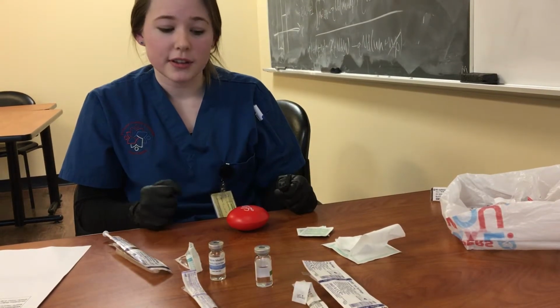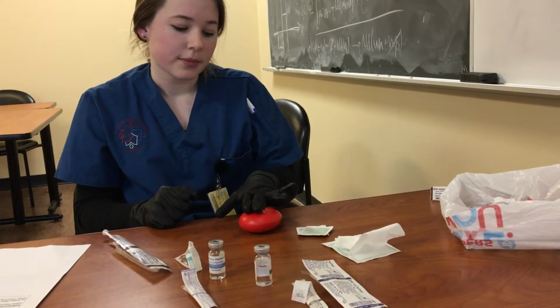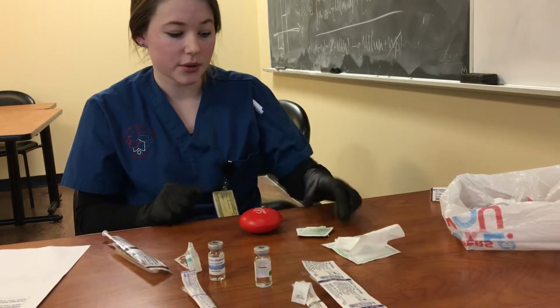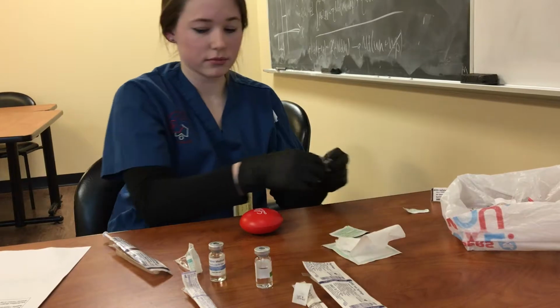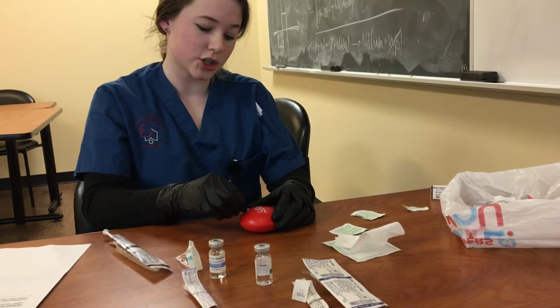The important thing though for landmarking is that I want to be 2 finger widths below the umbilicus, and I don't want to go any higher. So now that I've landmarked accordingly, I am going to open my alcohol swab, and I'm going to clean in an inner to outer fashion.